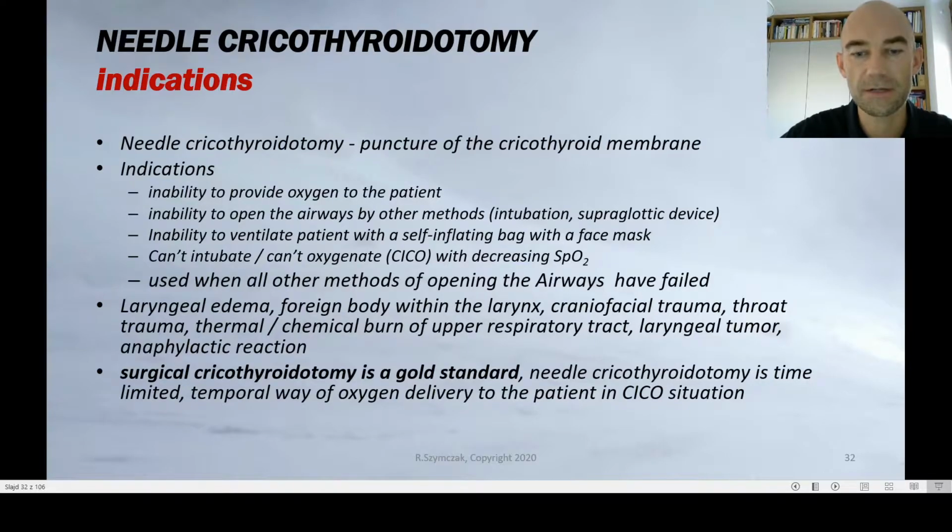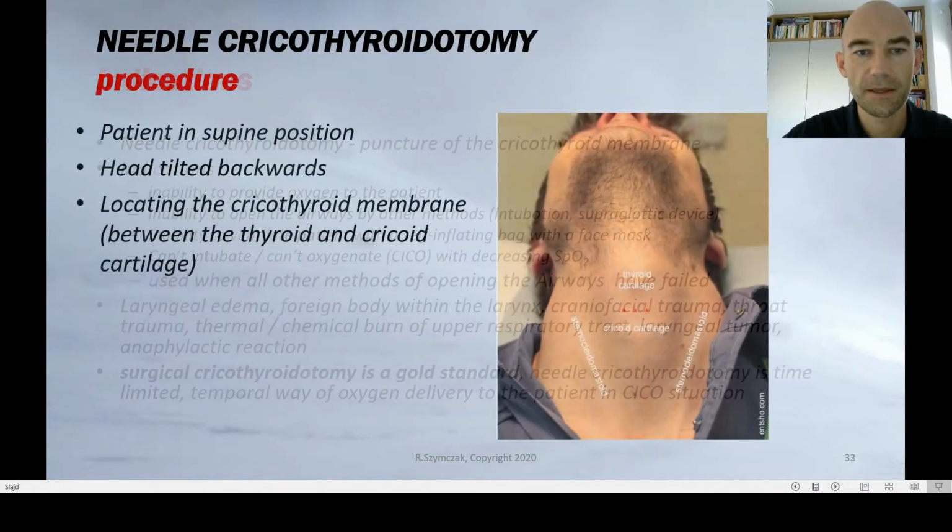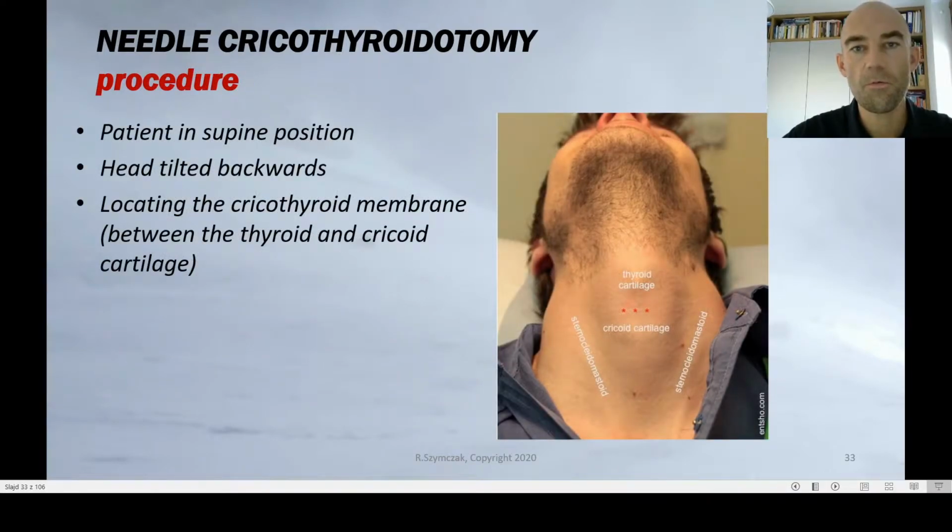That's the gold standard. The needle cricothyroidotomy is a time-limited procedure, a temporal way of delivering oxygen to the patient in this CICO situation. Okay, so remember, it's not a gold standard, it's just a temporal way. So how does the procedure look?